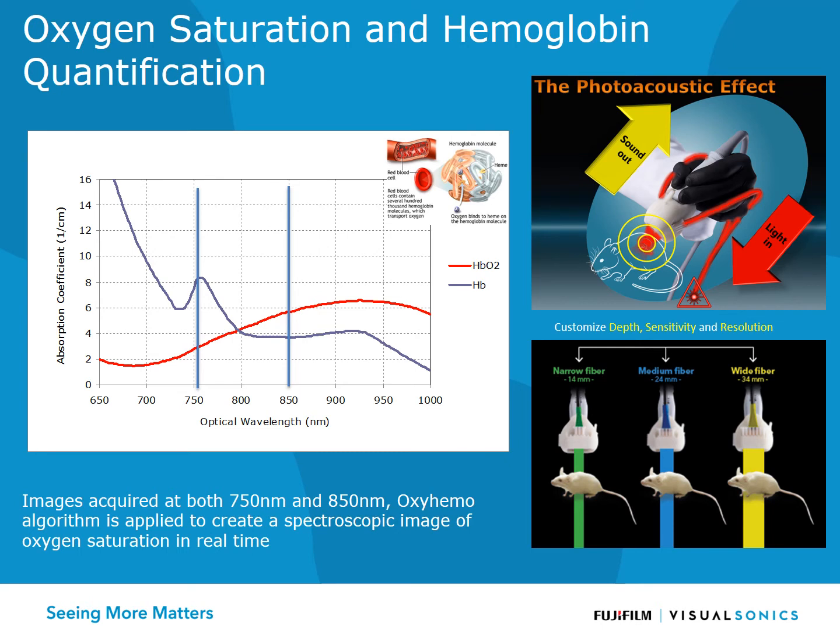And we know at which wavelengths the deoxyhemoglobin absorbs the most light and at which the oxyhemoglobin absorbs the most. And when absorbing a lot of light, a high photoacoustic emission is produced. By detecting the deoxy and oxyhemoglobin, the system calculates the oxygen saturation percent level in the hemoglobin.